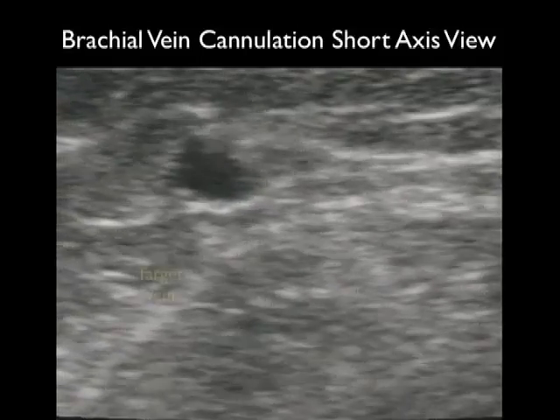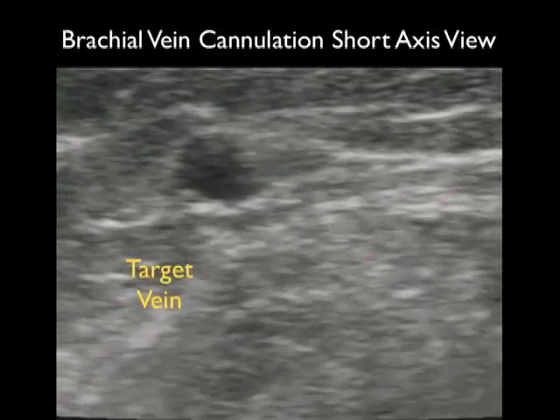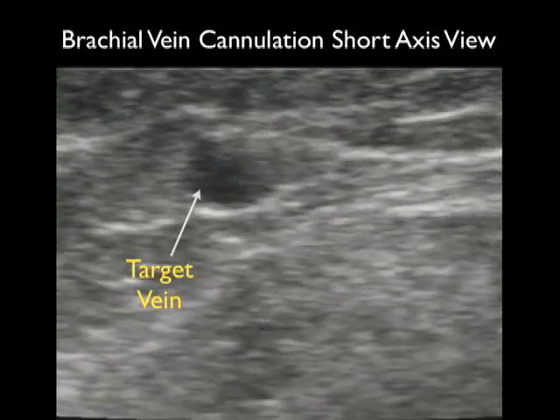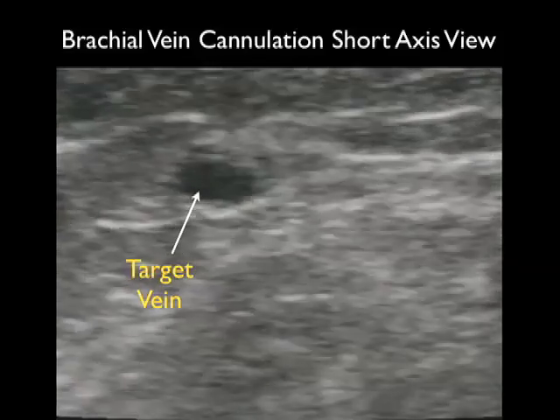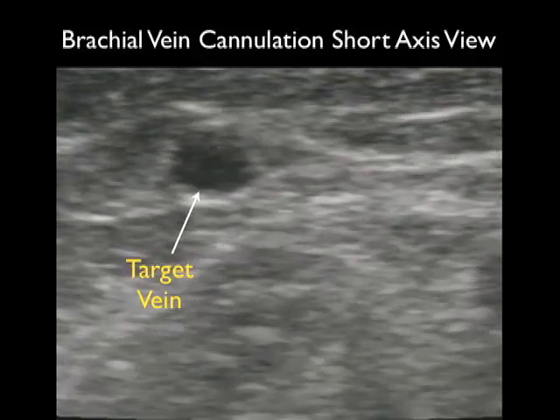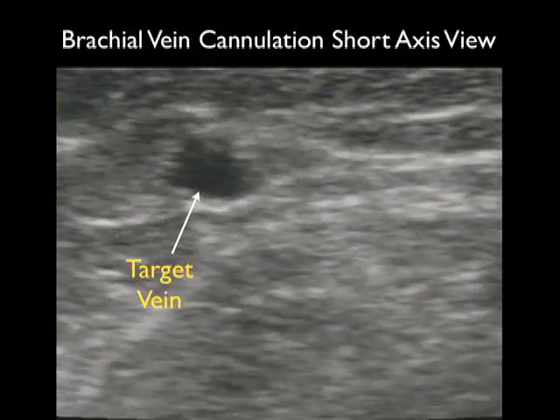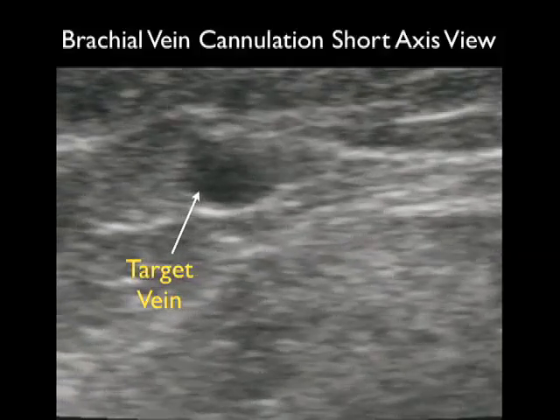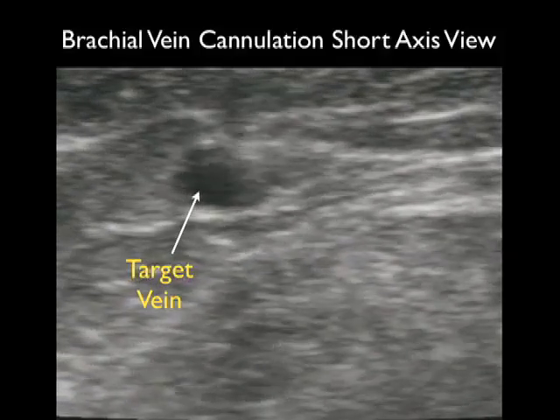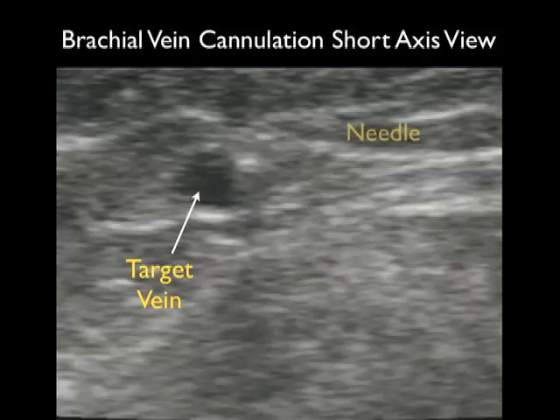This video clip shows successful cannulation of a brachial vein using the short axis technique. Notice we see the vessel and the echogenic tip of the needle coming down from the surface, permeating the anterior wall of the vessel, with the echogenic tip right within the vessel lumen.